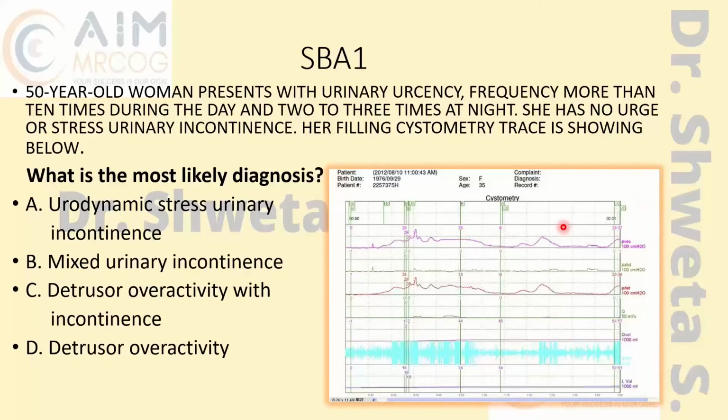Detrusor overactivity. Now I will tell you why I have put this graph, because you have to understand the small things. Oh yeah, I didn't see that. There is a small leak. So that's a leak then. Yes, very good. So what is your answer now?